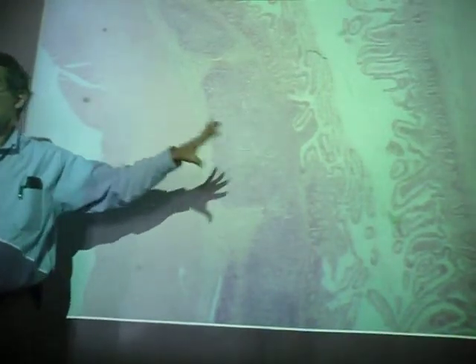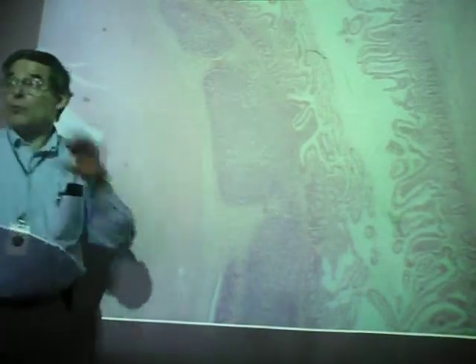And remember what lymphocytes look like when you look at those blood smears? Big purple nucleus and very little cytoplasm. When you have them in stained tissues, they often look like little purple granular areas. In this case, Peyer's patches, part of the MALT. Any other questions? Shouldn't be that bad. Should all get an A.